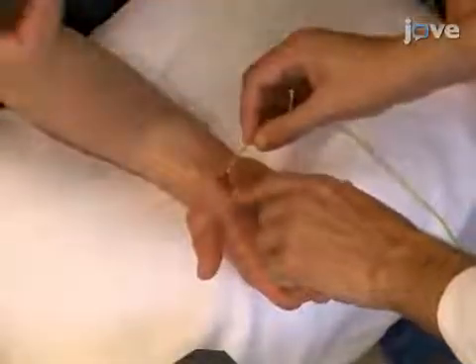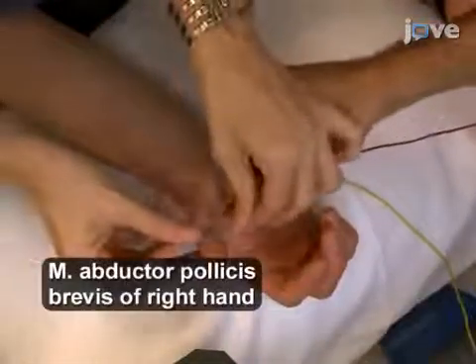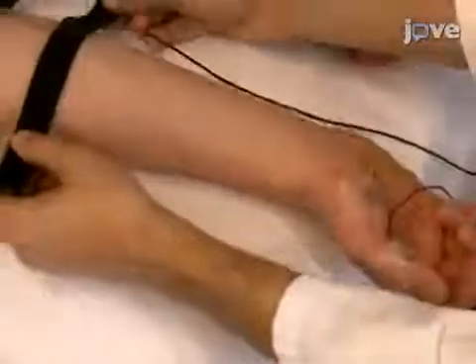Attach the electromyography or EMG surface electrodes in a belly-tendon montage on the hand muscle of interest, and connect a ground electrode.